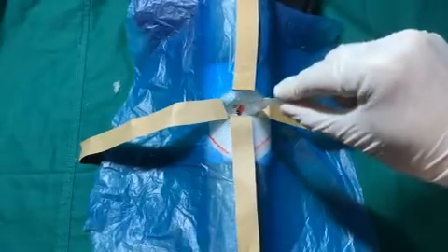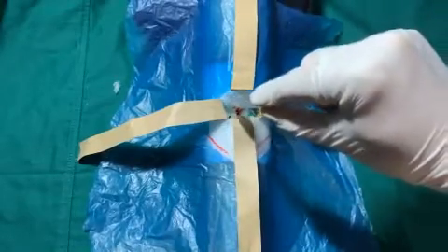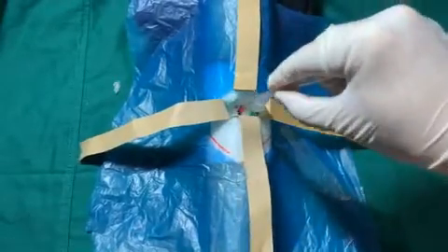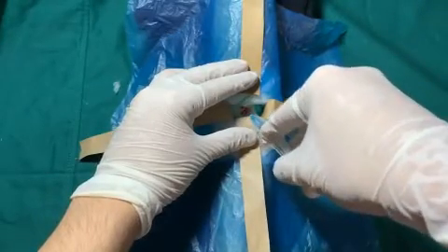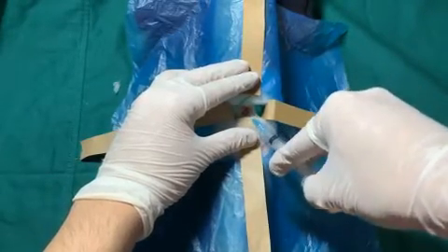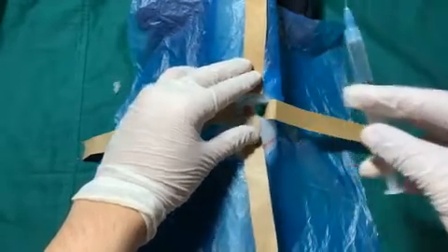Ensure that the cervical field is completely dry before proceeding, as it is difficult to achieve hemostasis once the tracheostomy tube has been inserted. Should there be doubt whether it's a trachea or carotid artery, aspirating air with a needle attached to a syringe will confirm its location.